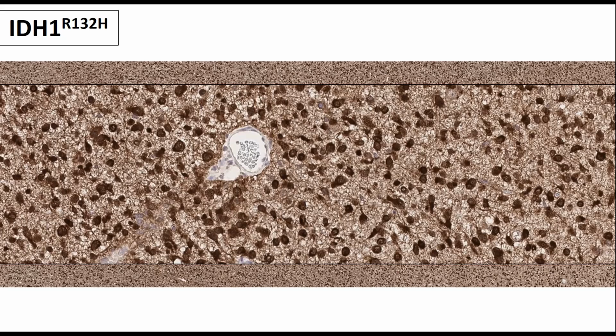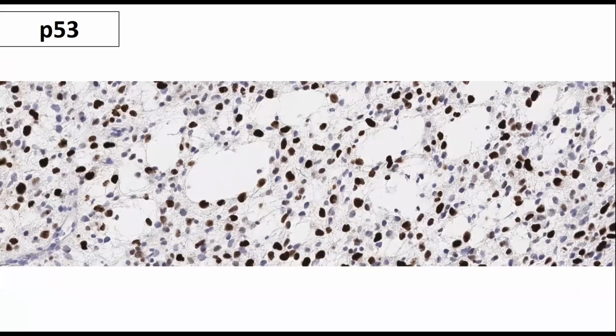The beautiful thing for us as diagnostic oncologic pathologists about the IDH1 R132H antibody, and about the biology, is that essentially 100% of the tumor cells express the mutant protein. So if your immunostain is working well in your laboratory at your institution, you can pick up single cells way out distant with a high degree of confidence that that's infiltrating tumor.